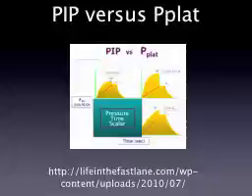And basically on the y-axis, the vertical line, if you look in the upper left corner, the vertical line up and down is pressure, and then the horizontal line, the x-axis, is time. So this is basically making pressure a function of time.